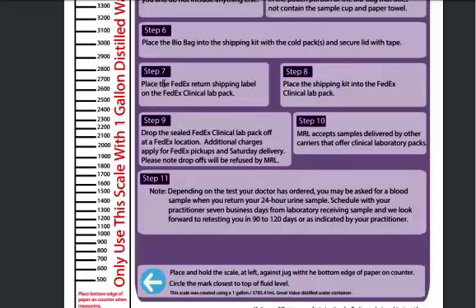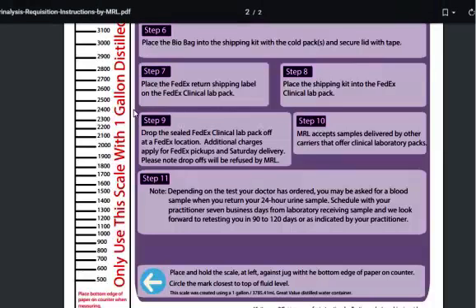These boxes stay shut inside the FedEx bags really well, so if you put tape on it, that's okay. It doesn't need to be a lot of tape. We get them duct taped up. Believe me, we've done this so long, I've seen everything. Dinosaur stickers on them and everything, that's okay.